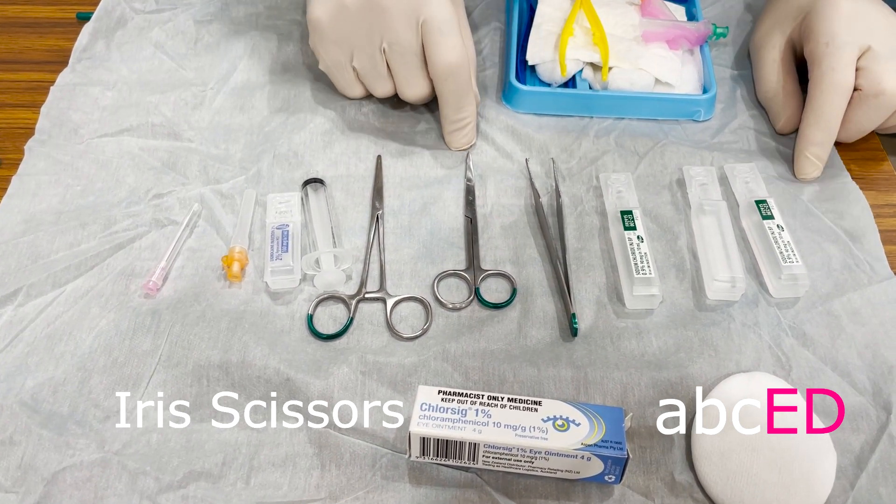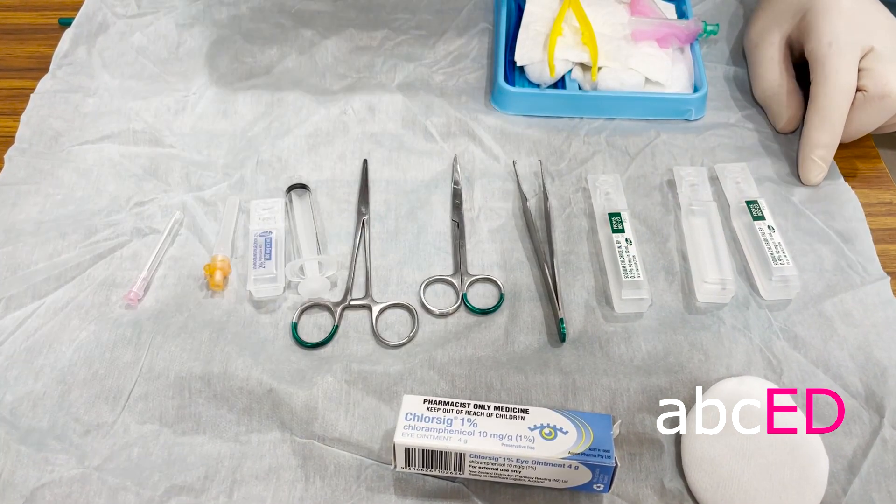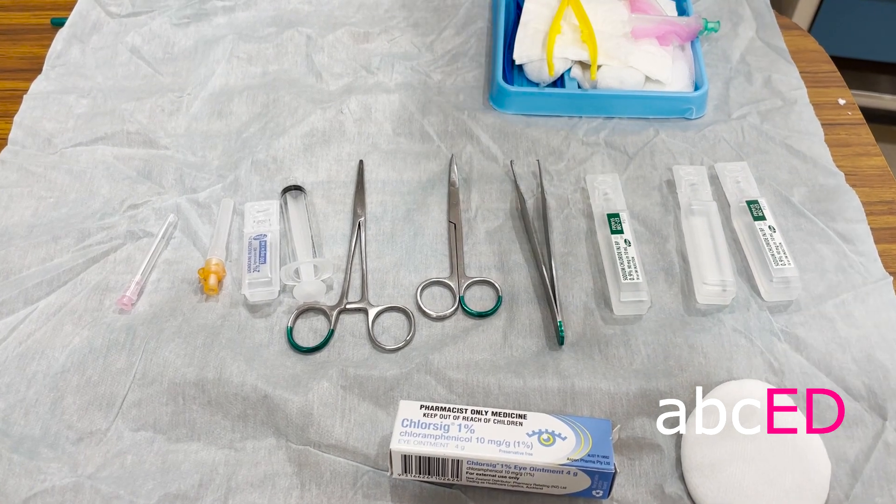Small scissors to cut with, toothed forceps, saline to clean with, a pad, and some antibiotic ointment to finish.